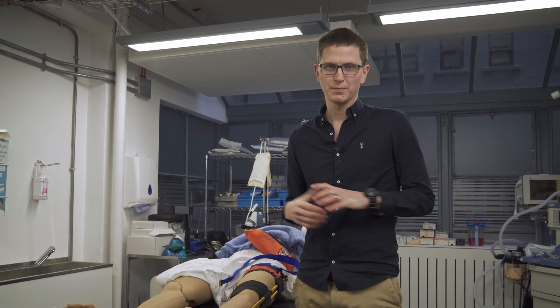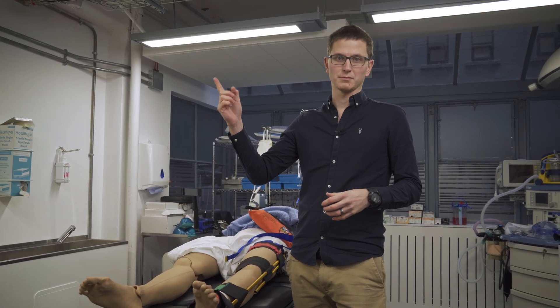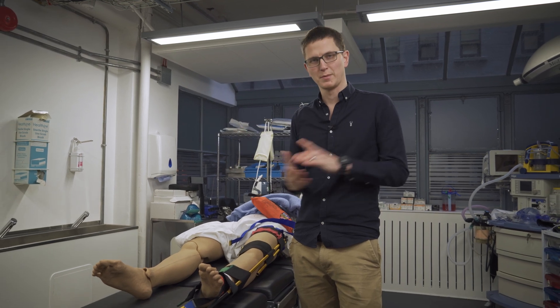And that is the Kendrick Traction Splint. Any questions, please drop them in the comments — I'd love to know. If you enjoyed this, you'll probably want to check out my trauma videos; you'd find them quite interesting.